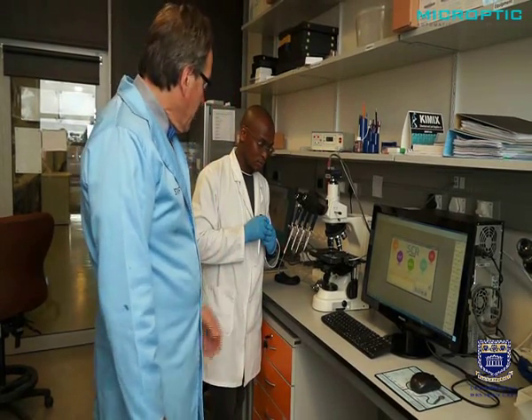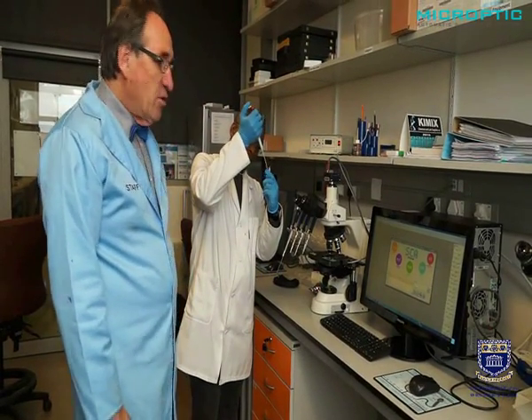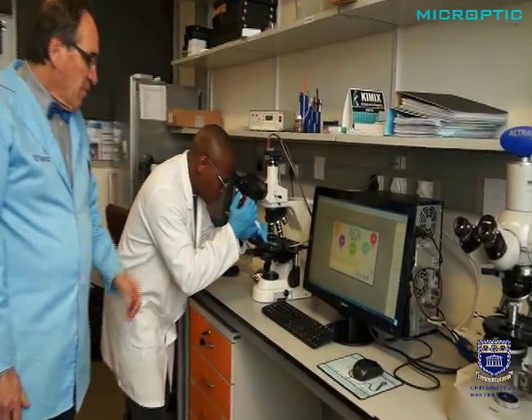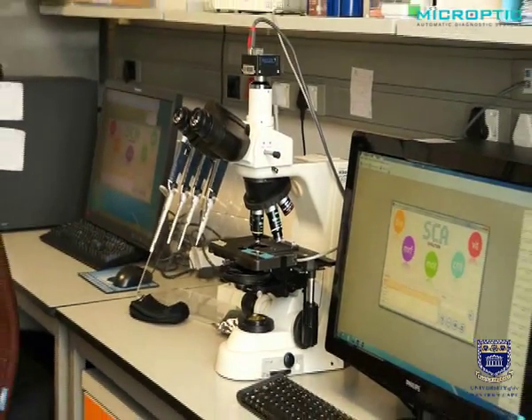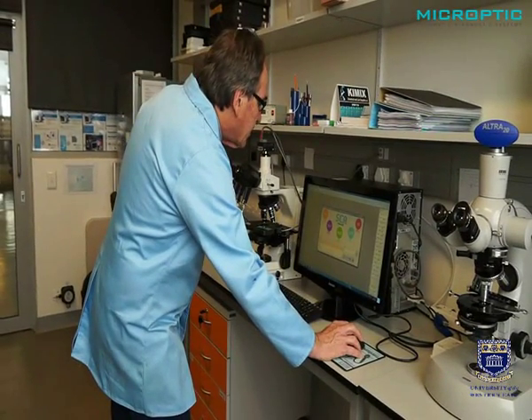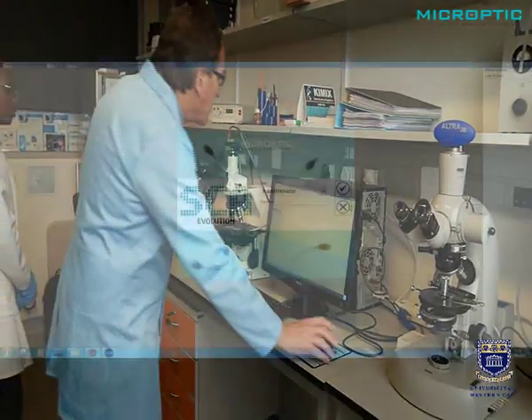Now that we've completed the setup, all the components of the computer-aided semen analysis, let us show you how we do it. First of all, we load the semen sample. And again, a positive displacement pipette is used. We inject the sperm carefully. We leave it there for approximately 30 seconds. In this time, I have already selected the configuration that I require, in this instance human sperm.